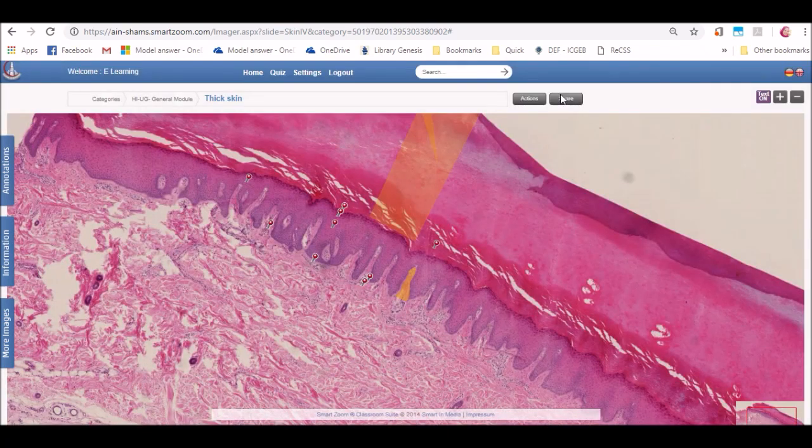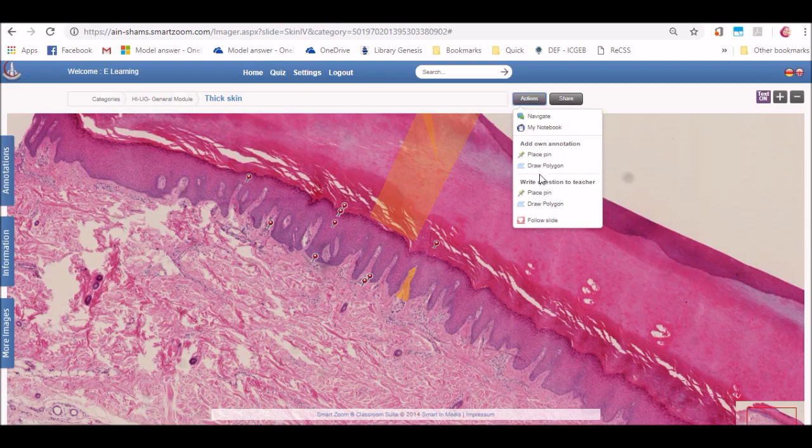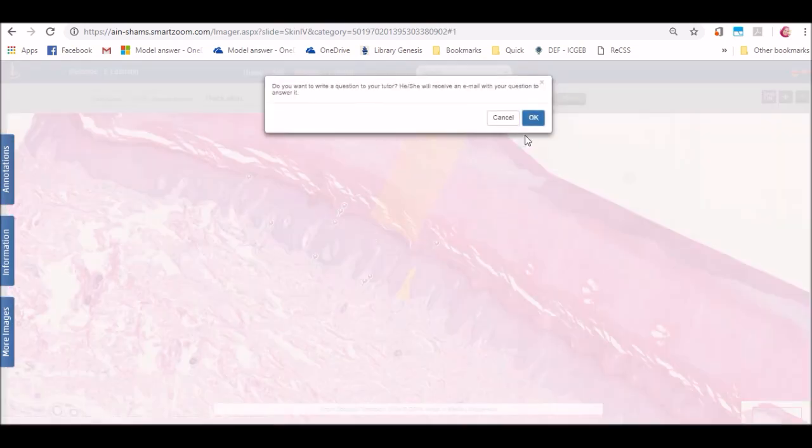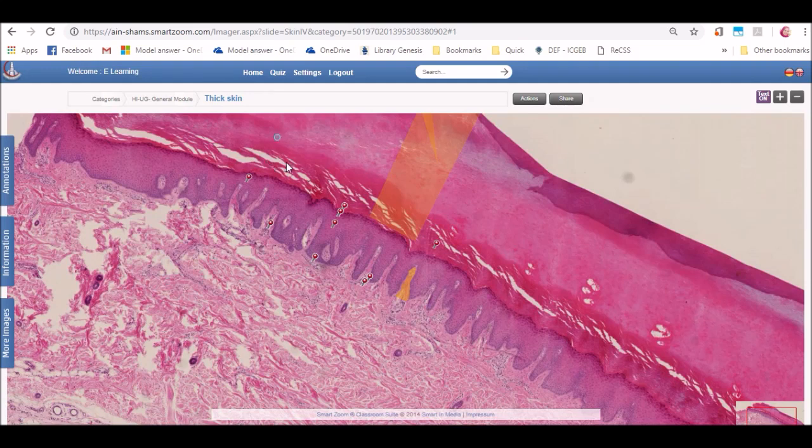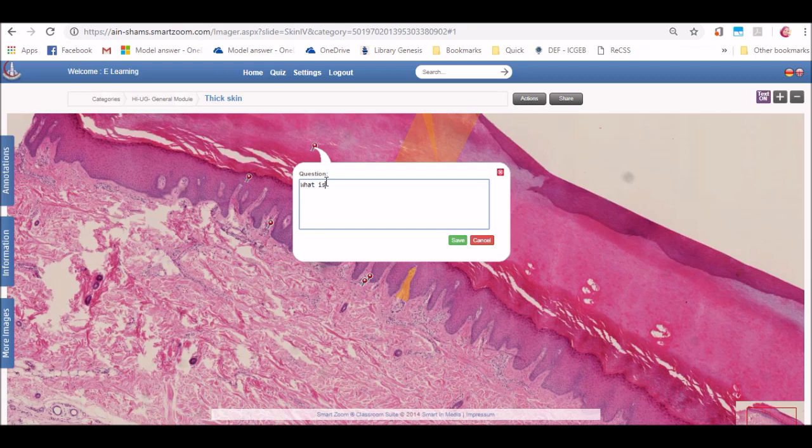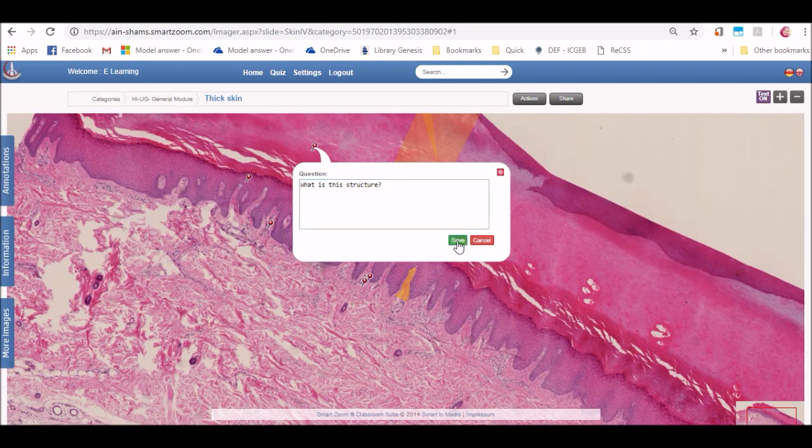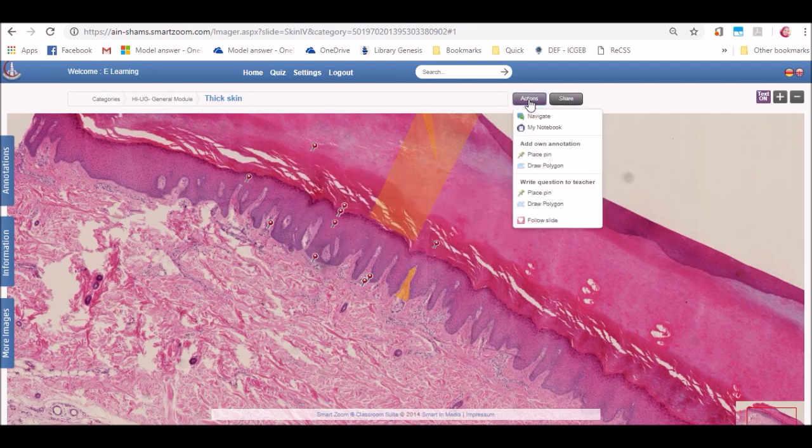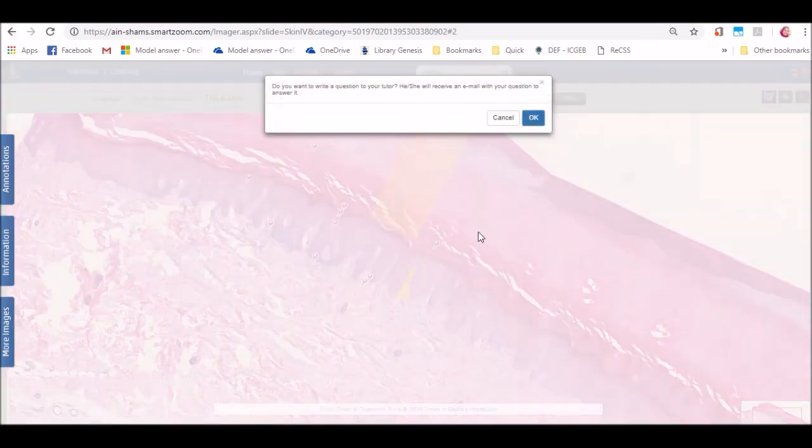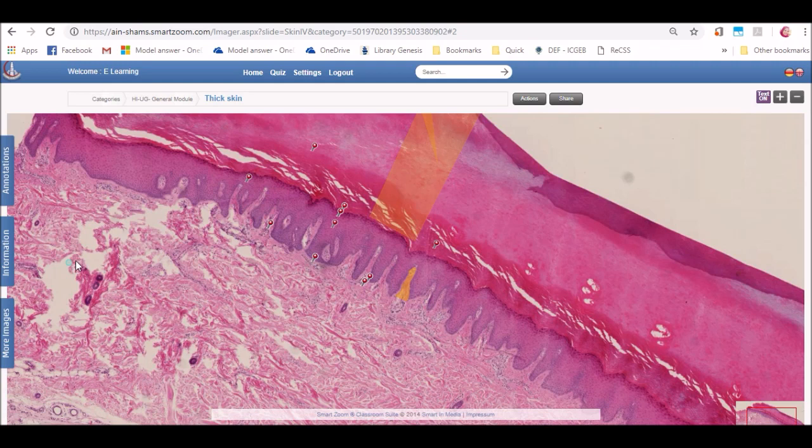The fourth feature is asking questions. Return to actions and then click on write a question to a teacher. Then click on OK. And then you can place a pin or a shape annotation in order to ask about a certain structure or a certain area. This question will be sent immediately to the administrators and annotators specialized in this subject. And a reply will be sent to you as soon as possible.